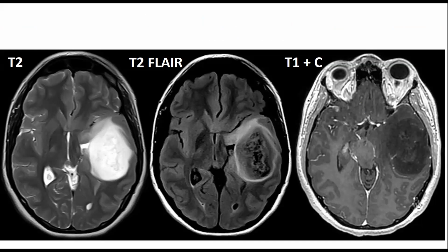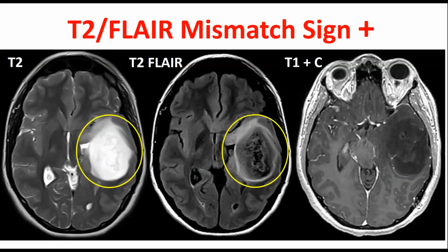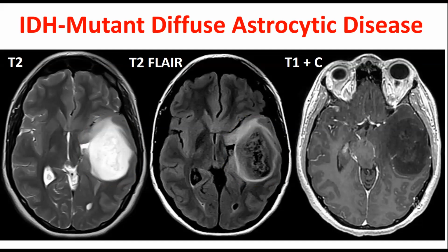We're gonna make it really quick. Here it is. I'm showing you T2 flare, T1 plus contrast diagnosis. All right, done and done. Yeah, I know. But listen, if even one person in this conference does not know the T2 flare mismatch sign, then it's worth going through it.